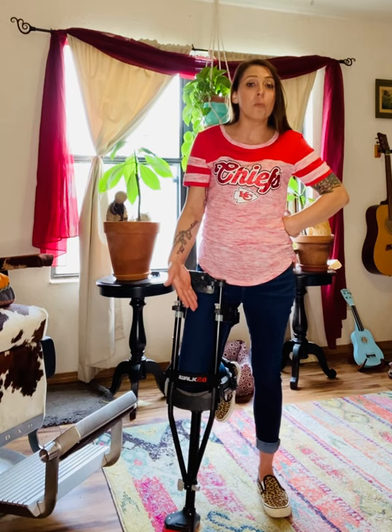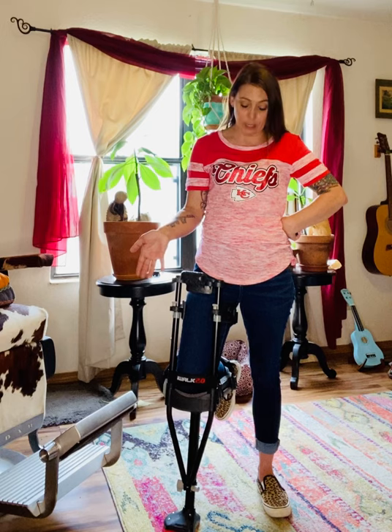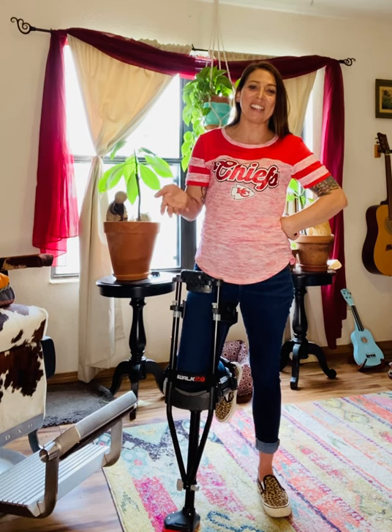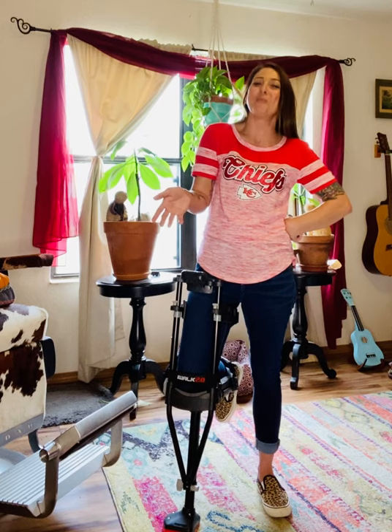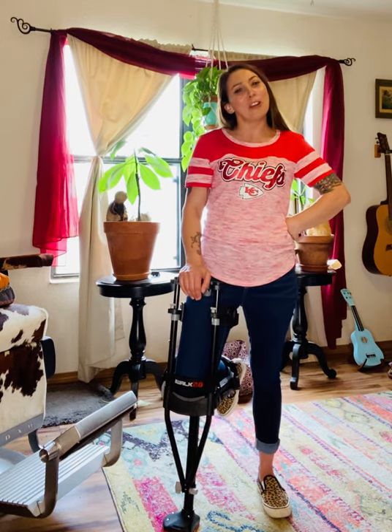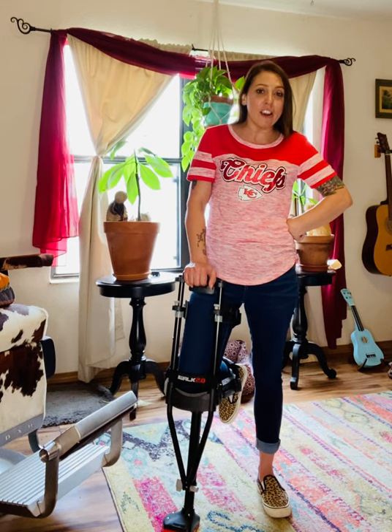So the iWALK 2.0 hands-free crutch can be a really great solution for the right person. You can't just pick it up and use it immediately — I will say I have struggled a little bit and almost fallen backwards myself a couple of times, so it takes a little bit of practice.